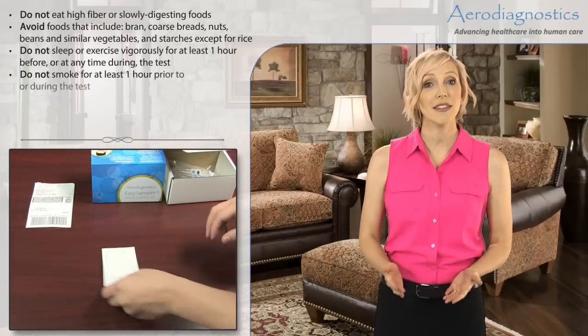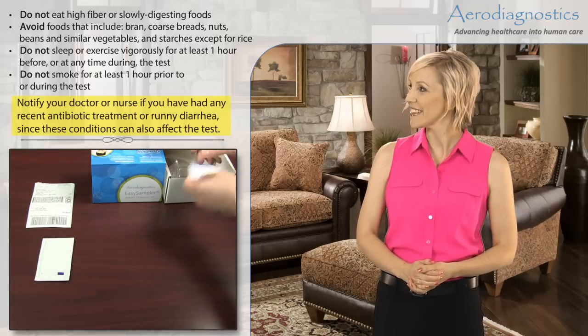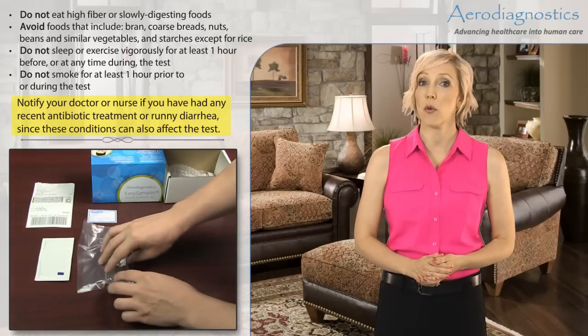Test Kit Preparation and Sample Collection. The process of preparing for and collecting breath specimens is easy. On the day before the test, it is important that you avoid the following.